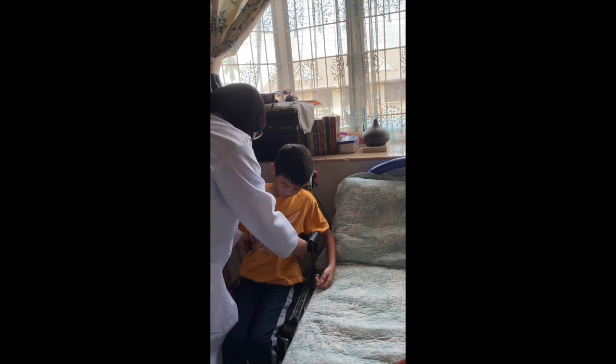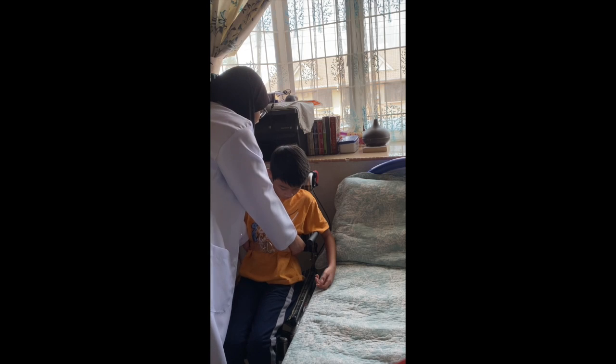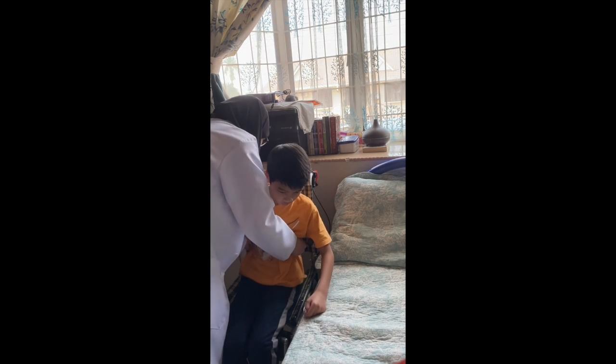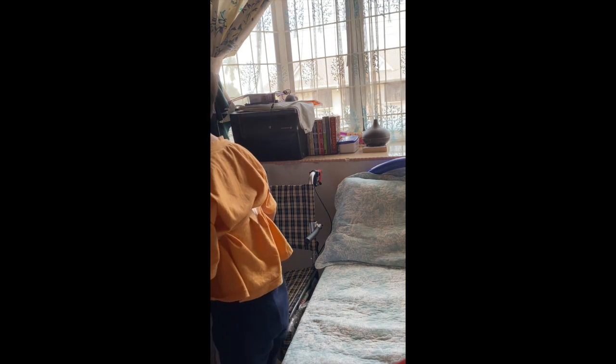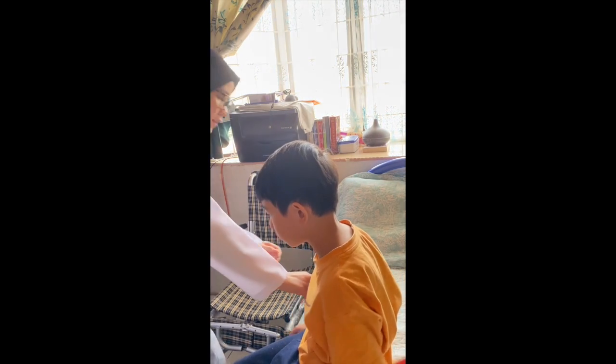I will grasp the gait belt on the side and assist the patient to stand up on the count of three. Okay, so one, two, three — stand up, turn around and sit. Remove the gait belt.